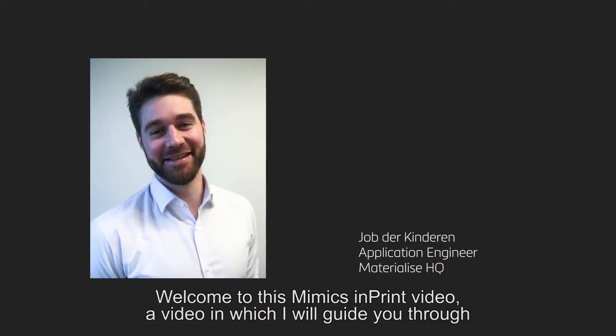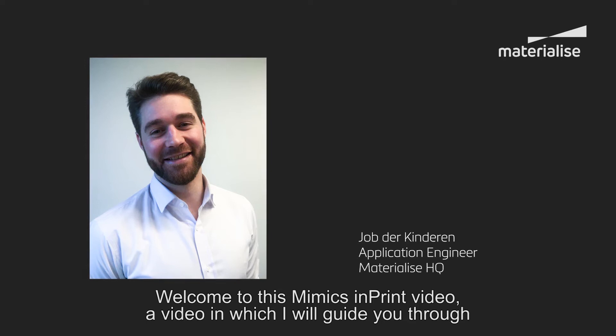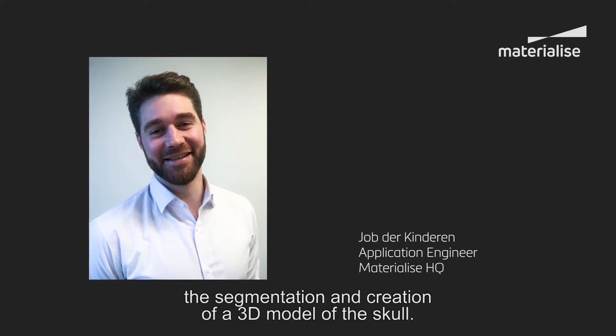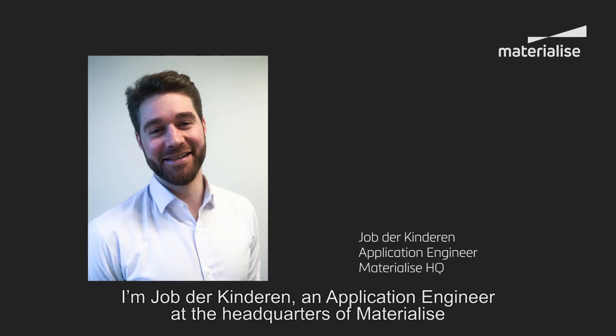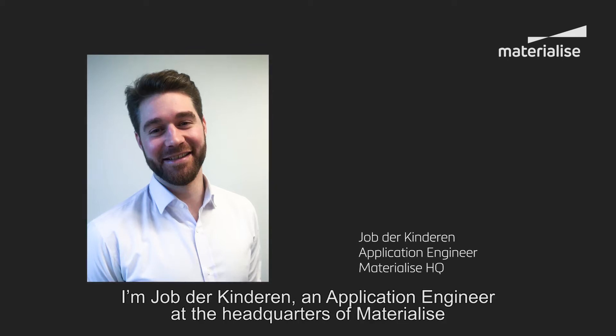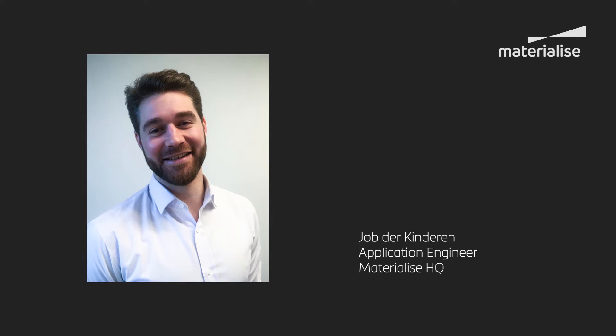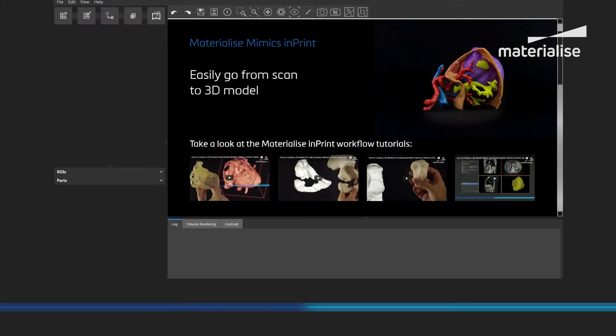Welcome to this Mimics inPrint video, a video in which I will guide you through the segmentation and creation of a 3D model of the skull. I am Job der Kinderen, an application engineer at the headquarters of Materialise in Leuven, Belgium.